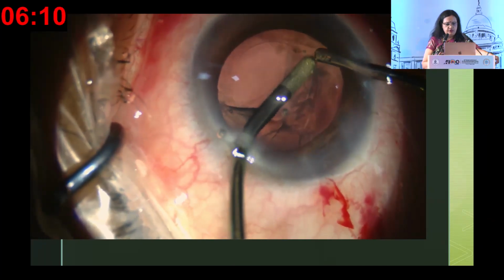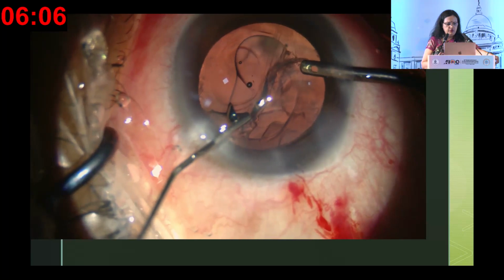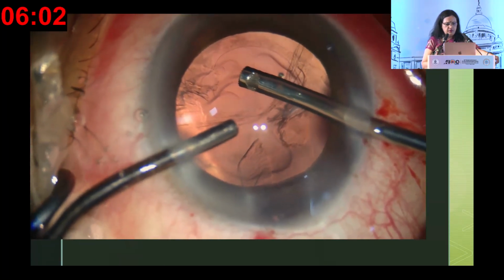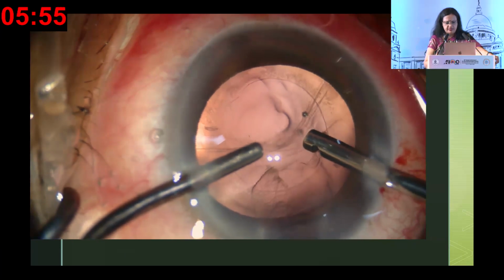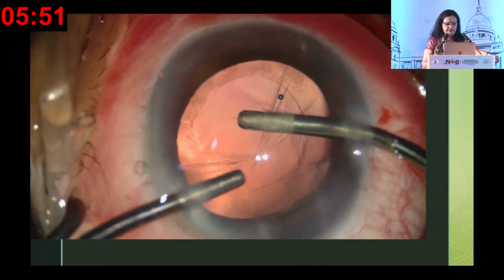So you will have to start doing a vitrectomy. It has to be a bimanual vitrectomy, and to prevent further worsening of the opening, you inject some viscoelastic and do vitrectomy cutting. You can use the same vitrectomy cutter to aspirate also, once you have removed all the vitreous. Don't aspirate in the presence of vitreous.